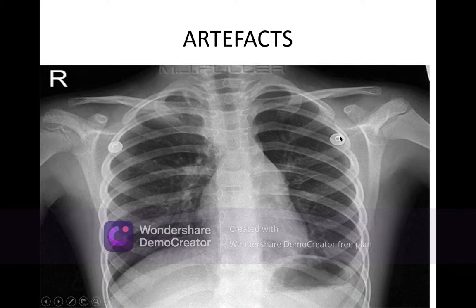Artifacts, man-made. These are the man-made opacities. You see, some radiographer has created it. Or this is the one, and this is the one.